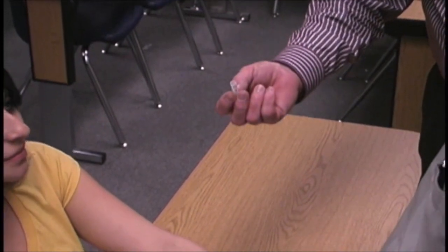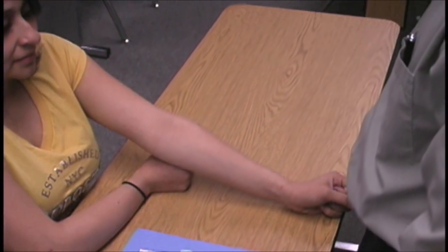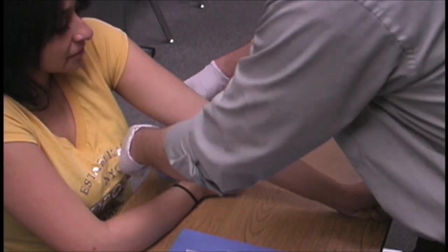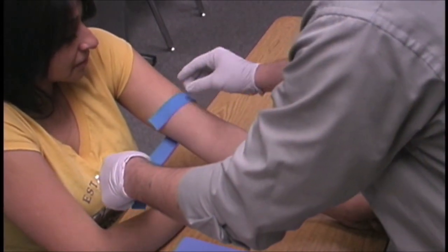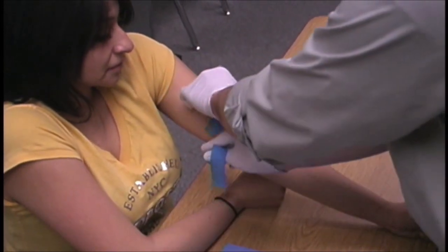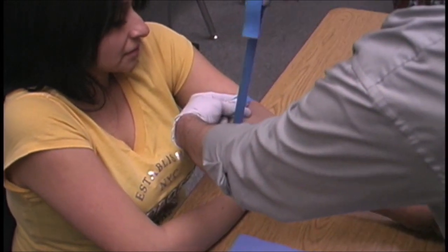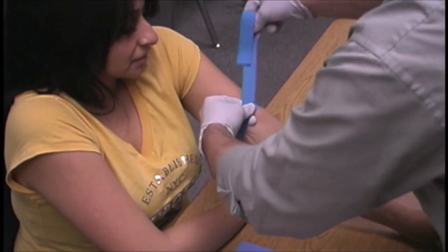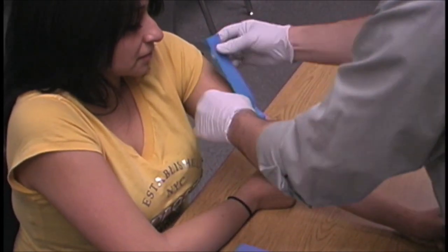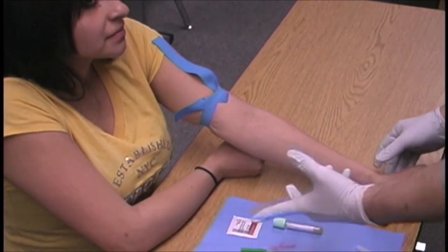Next, Al picks up his tourniquet and places it approximately three to four inches above the antecubital fossa. Watch as he places his left hand under the short piece, long hand on the right piece, lifting up, crossing over, and making a small tuck. This tourniquet placement brings the vein up and distends it so that we can palpate it and inspect the area.